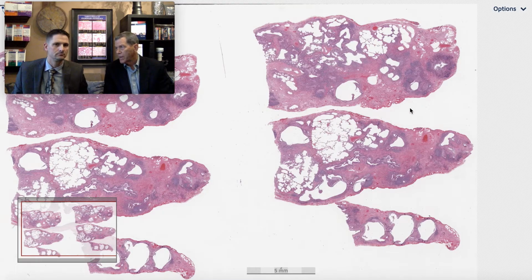And because it's such a bad diagnosis, if they can't make the diagnosis by other means, they're going to take the patient for a surgical biopsy. Exactly. Nowadays if the patient has classic IPF radiographically and clinically, they won't even go to biopsy. But this patient, we know that there was some abnormality, either what the radiograph showed or the clinical presentation, and the fact that she's a woman might have been it. Right. So here's a wedge biopsy. This is from the lower lobe.